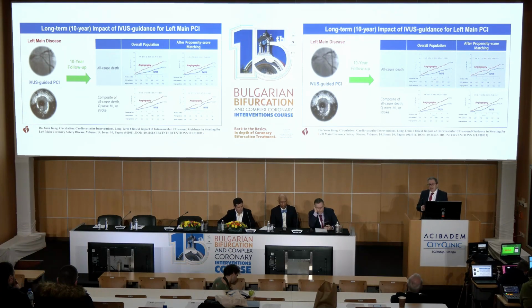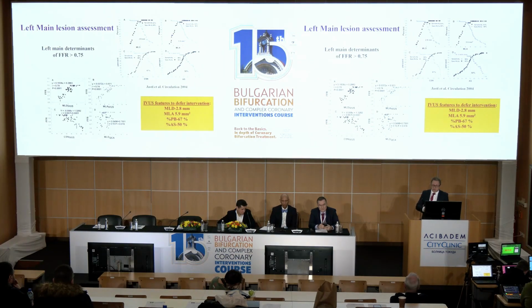So it means this investment at the beginning, especially for this portion of the coronary circulation, is very, very important. We should keep in our mind. If we are talking about intravascular ultrasound, we have to keep in our mind also the fact that this technique was tested in every possible situation.